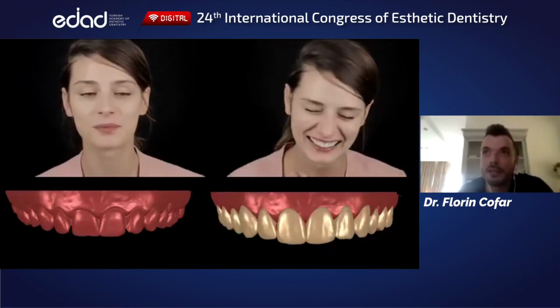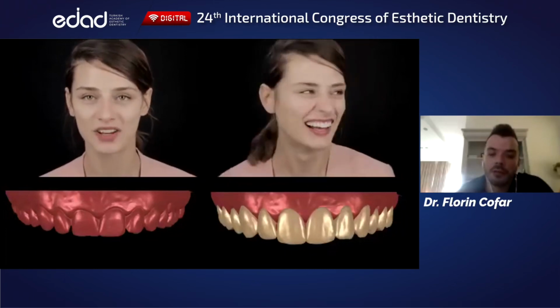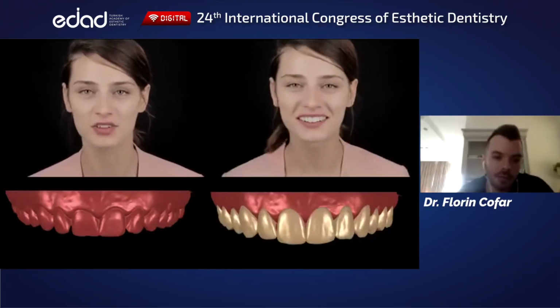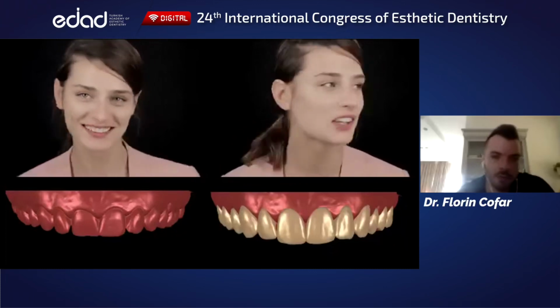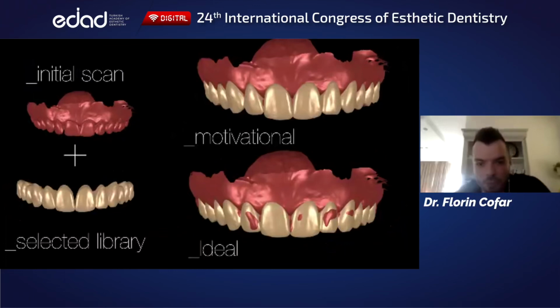Realistic is you need to start. What I'm showing here, do not think of it as aesthetics, but think of it as communication. You always start with communication, because in the beginning, what you need from a patient is him or her to say yes. So basically, this motivational mockup is, the only use that we find, to communicate visually a certain treatment plan that involves aesthetics.